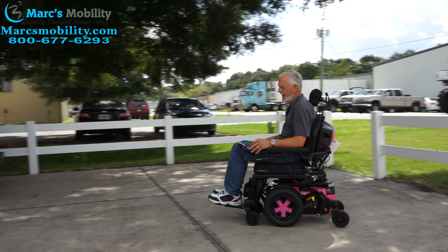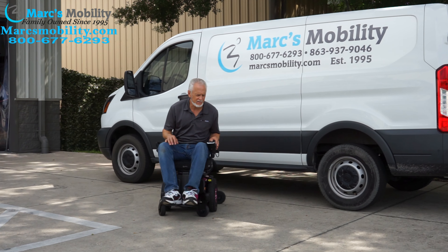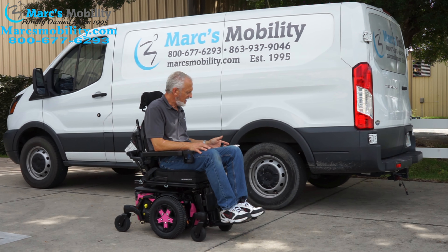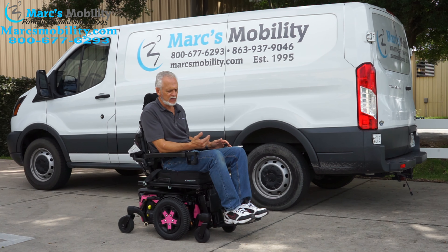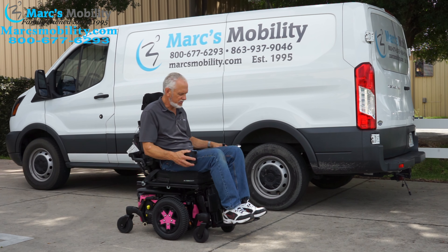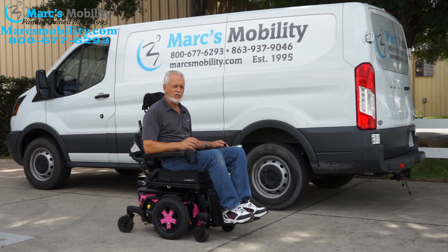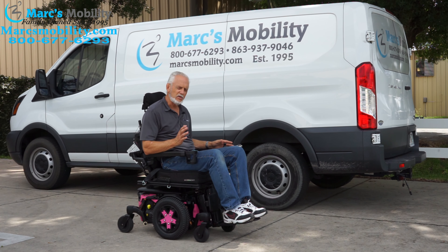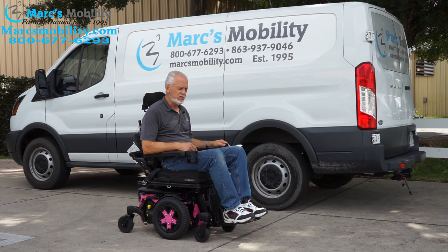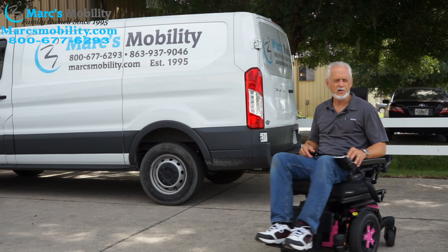It does go in the grass. Top speed is 6.2 miles an hour. It has 12 miles, the electric tilt, electric recline, electric feet, swing-away joystick, cup holder, and light kits on the fenders with suspension. If you're looking for a smaller Quantum chair, this is the Stretto 3 at 22 inches — these have been very, very popular lately, and this one is ready to go.